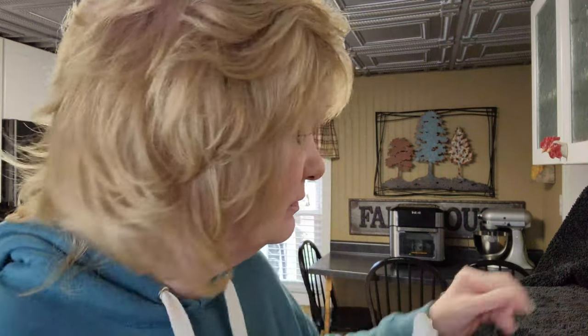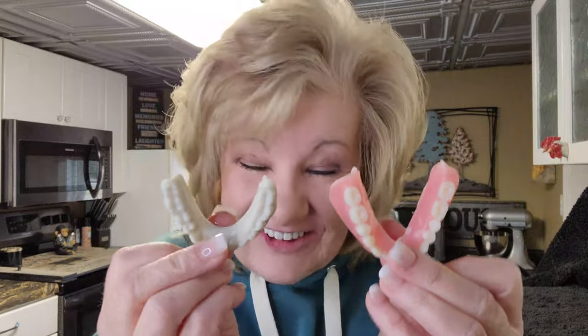Now let me put my immediate dentures in. Keep in mind that these have a reline in them because they're huge. But look at how tiny the try-ins are — they're just tiny little things. These are the ones I wear all the time that you see me in videos. Look how big and bulky they are. And after having those in... big difference.